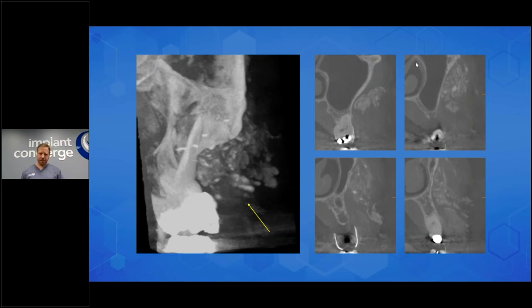More answers: bone graft, shotgun to the face, cheek implant, facial fillers, dermal filler, silicone injection. Yeah, it was Restylane. I'm not sure exactly the pronunciation, but that actually is really cool. That's very close to what it looks like after they do the implant or the filler material. But I'm telling you, when I saw it, I was like, what the heck? What could that be? And she finally admitted to it, to filler material.